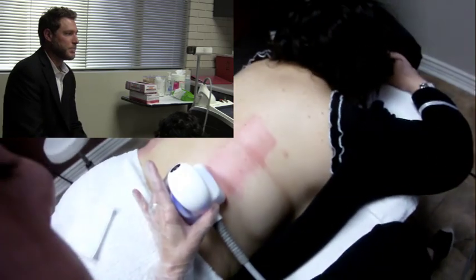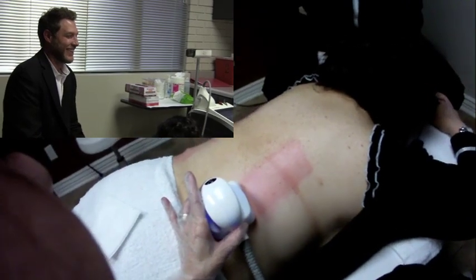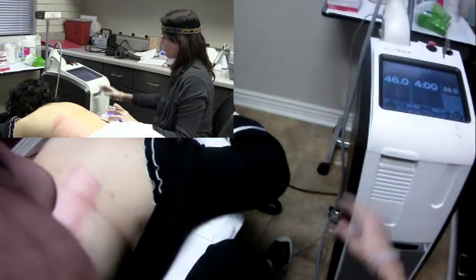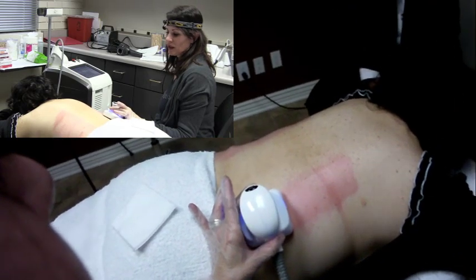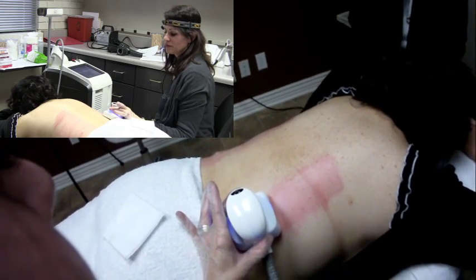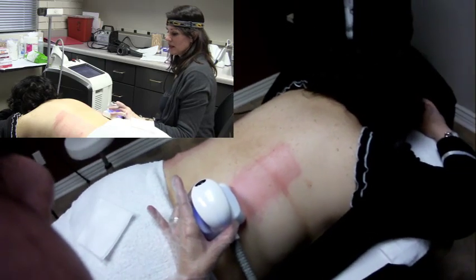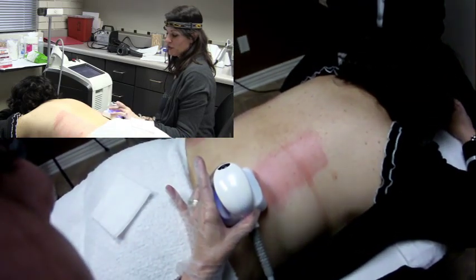Anything that gets rid of fat we like! We were going to pretend we were like real housewives and eat pizza while doing this today, but that didn't work out so well. What I'm doing is just trying to take the temperature up. The cost of this treatment anywhere on the market could be probably $1,000 to $2,000 — $1,000 for one, but protocols at most places are typically charging anywhere from $1,750 to about $2,000.